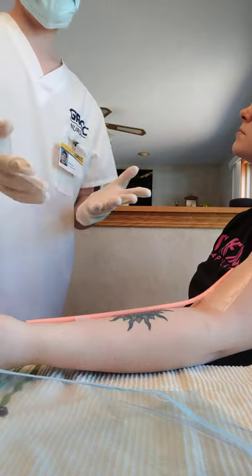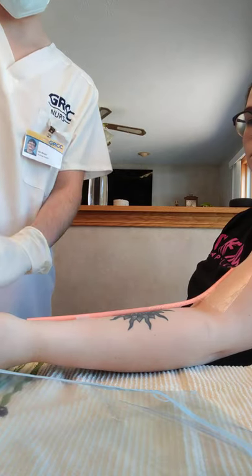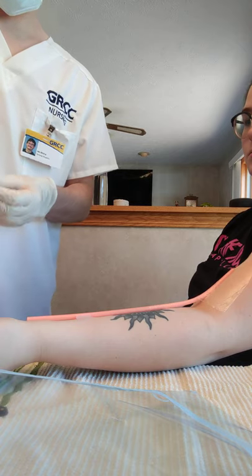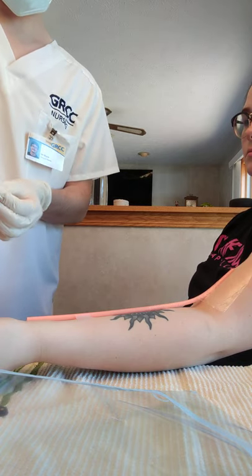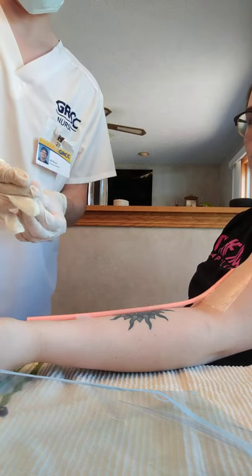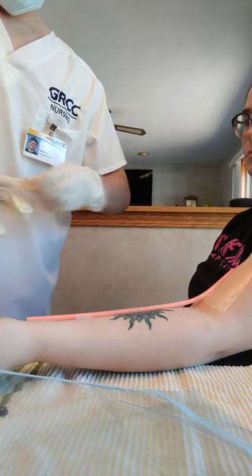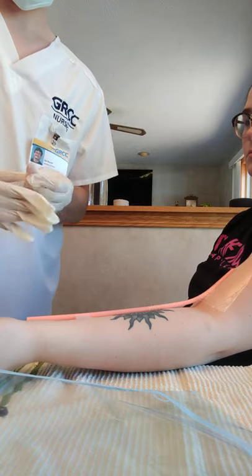Now that I've applied the new dressing, I'm going to remove my sterile gloves and dispose of them. I have to reuse these, so that's why I'm not throwing them away the normal way, since we're just simulating.